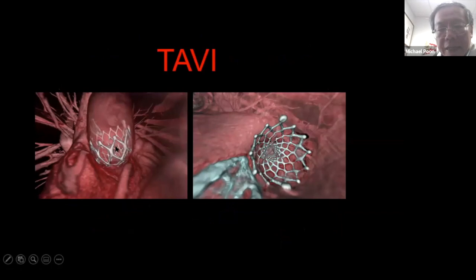And this is another CAT scan image from my file, a patient who had a very tight aortic valve, which I showed you earlier from those 4-dimensional MRI images. Do you remember I talked about when the blood velocity is very high, the colors start to become red? You have to look at the valve to see if the valve is opening properly. And in this particular patient, the valve was not opening fully. With age, the valve becomes calcified and it doesn't open fully. And because of that, it generates a jet of high velocity. And with time, it could be very damaging to the body, to the blood vessel.